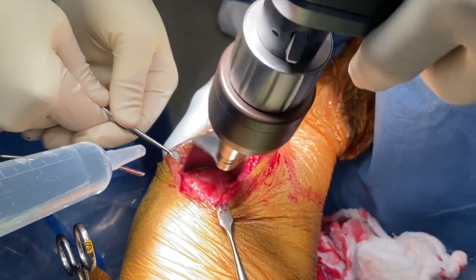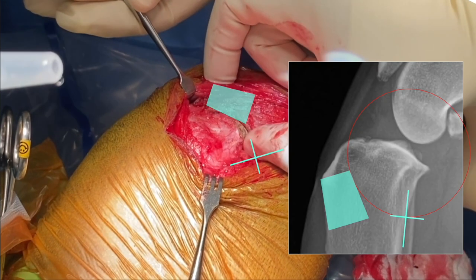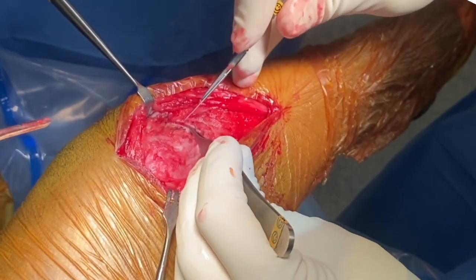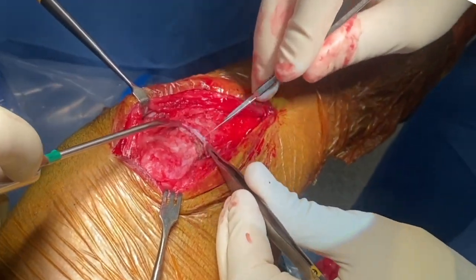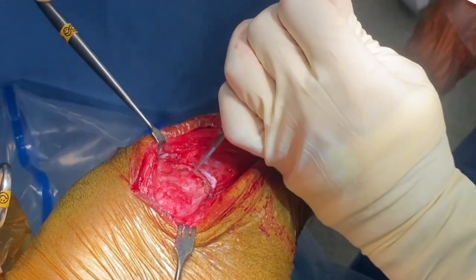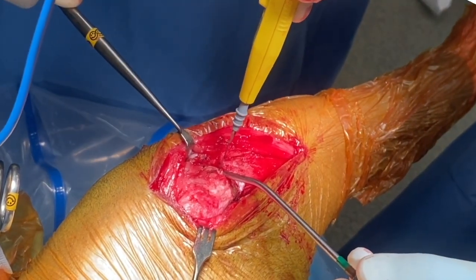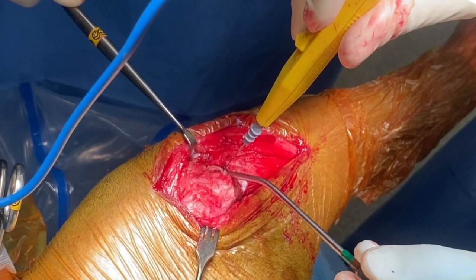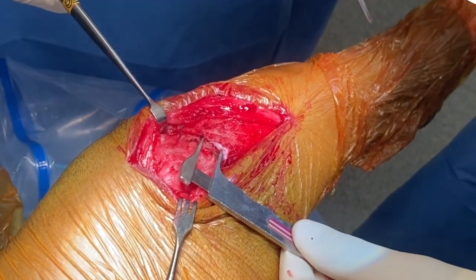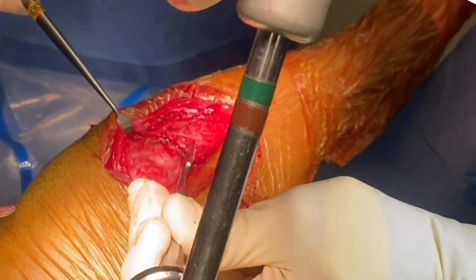The thumb supporting the tibia is positioned under the saw to prevent distal and cranial skidding of the blade. Once the osteotomy is established partially, the osteotomy site is again checked. Small sections of the periosteum are excised at the osteotomy on the proximal and distal segments and the bone is scored with an osteotome and electrocautery. A second score mark is created on the opposite segment at a distance as determined by a TPLO rotation chart and preoperative tibial plateau angle.